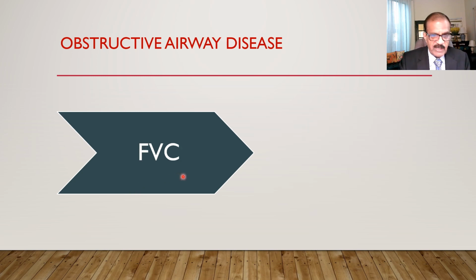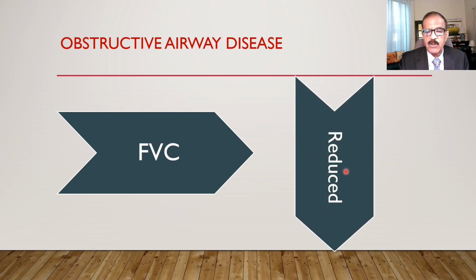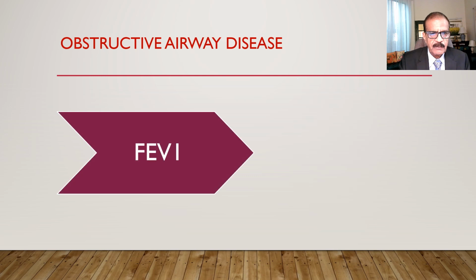FVC, forced vital capacity, is usually reduced because you have asked the patient to exhale as quickly as possible. So because of the time restriction, forced vital capacity will be reduced. So we use forced vital capacity in clinical situations. Next, forced expiratory volume during first second.